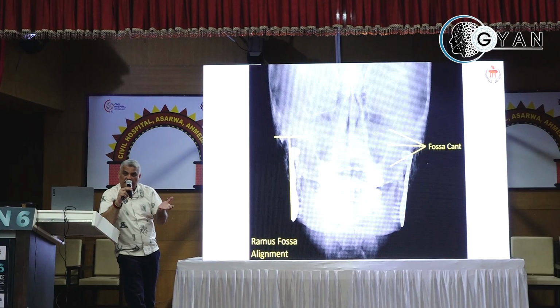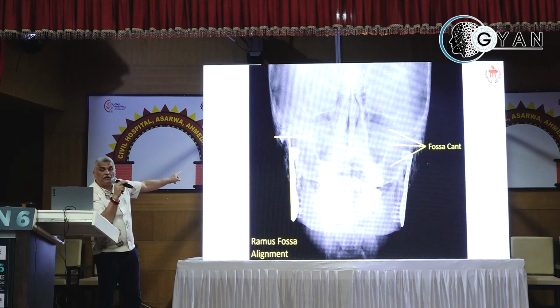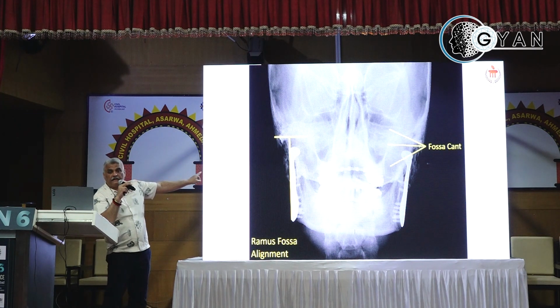If you're putting in a stock joint and you have the fossa component sitting in the skull base and it is free floating there, because the skull base is deep and you didn't recognize it on the X-ray, anything which is mobile in the oral cavity or anywhere in the facial region is asking for trouble. So you need to understand if the skull base is deep so that you can graft the skull base. These are extreme maneuvers what I'm speaking about. But from a planning point of view, this is what you have to do. Is that clear?